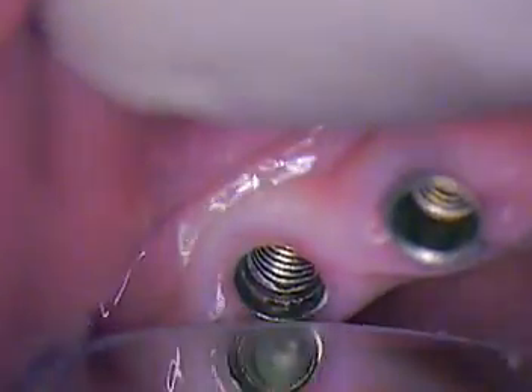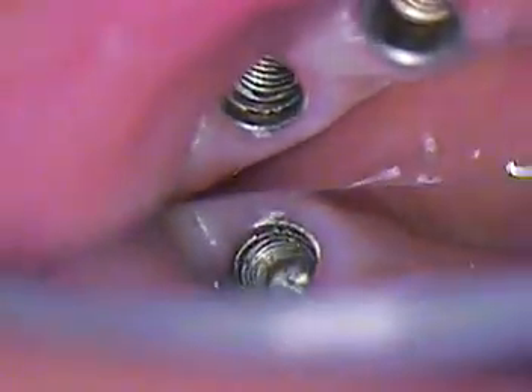I'll see just air in the mirror only. I'm going to look straight down — let's just see what we got going here. So I'm examining the threads. There's just one area, and the way that it looks, it might be able to get away with re-threading with plastic. We can see where the damage was done. I want to say it's probably about 20% of the thread, if that — maybe even less, maybe 10%. So we could get away with trying to go in with a plastic insert.